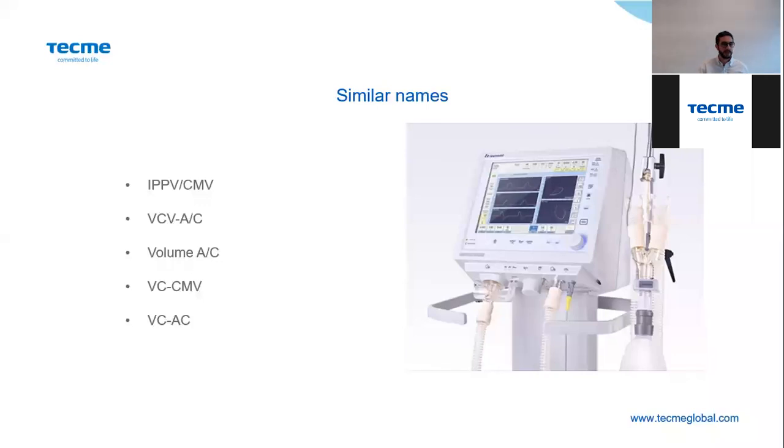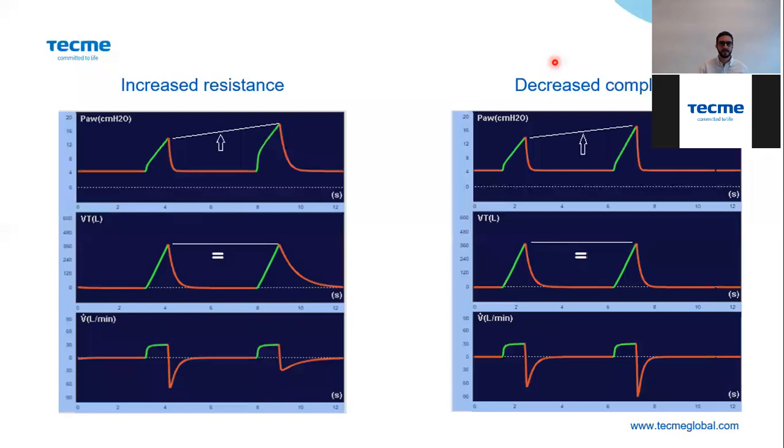So let's talk about the results with this image. The first question is, if the patient's airway resistance increases, what will happen to the inspiratory pressure?